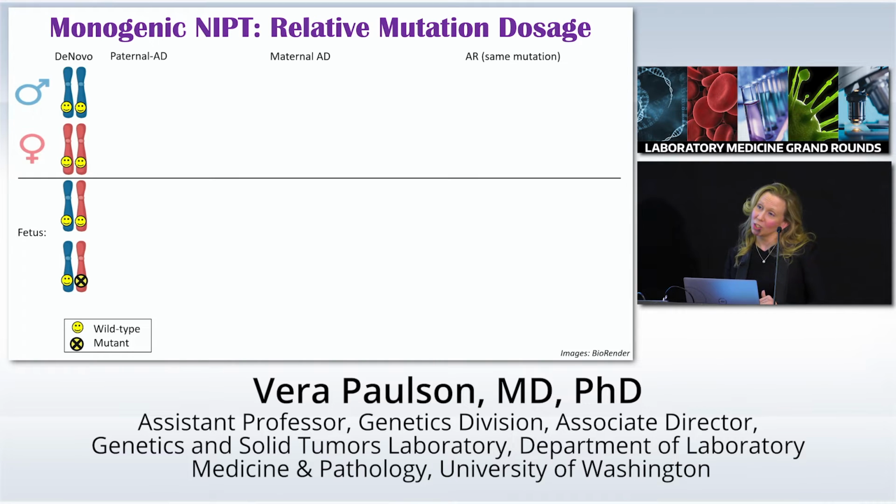There's relative mutation dosage and there's relative haplotype dosage. And I'm going to try not to lose you because I think I read this paper 3 or 4 times. It was really one of those, like, let me make sure I understand all the nuance to this. We have data up here, helpfully annotated mom, and then these are potential fetal outcomes.